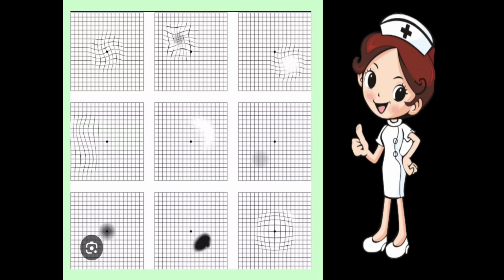In this case, the central abnormality is there. At the center, the patient sees wavy lines. In this case, the patient sees an image like this and will tell you that the boxes are like that. Here the boxes are missing at this side and some of them are wavy also. Here the lines are wavy. All lines are seen, but some of these lines are wavy.